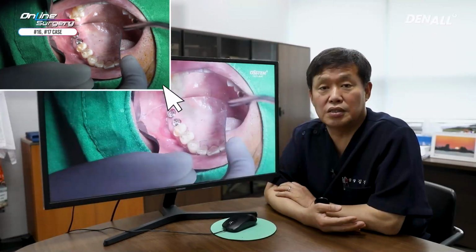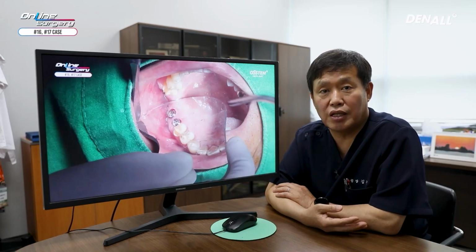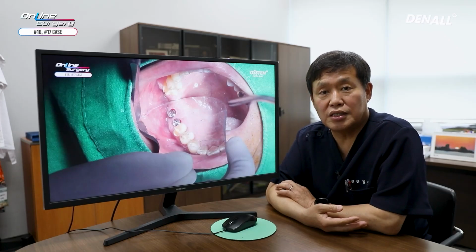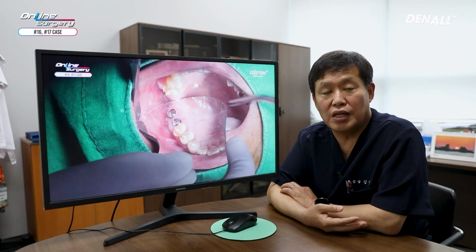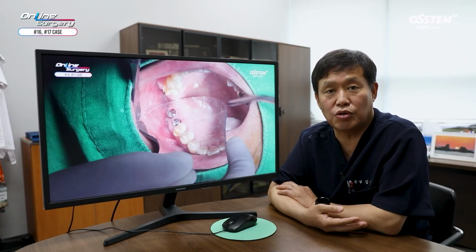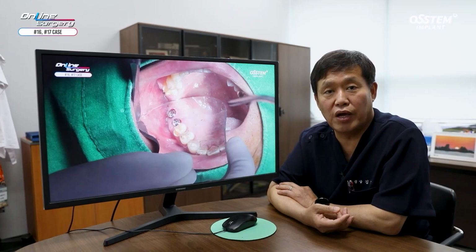Today's lecture centered around the question I received when placing a tapered TS3 implant when using the OneCAS drill. Because the drill is straight, people find it difficult to choose the final drill. Because it is upper posterior, you have to assume that it is soft bone. In order to place a 5 millimeter diameter implant, 3.8 is recommended. As for the OneCAS kit, because it comes in contact with the guide, it's difficult to get a tactile sense, so you need to have a 1.2 millimeter gap.